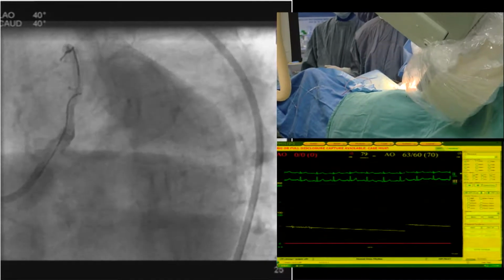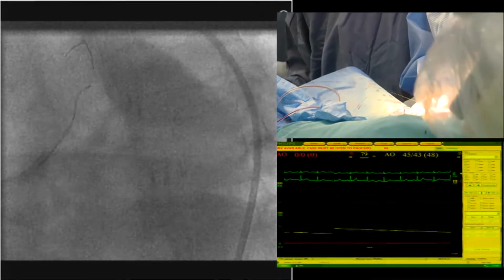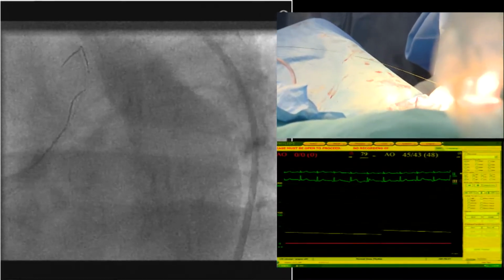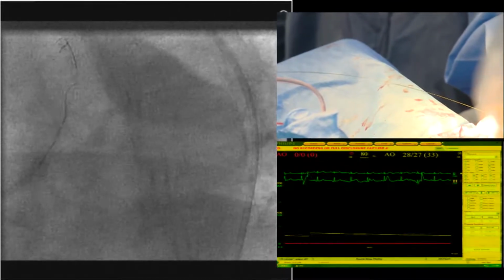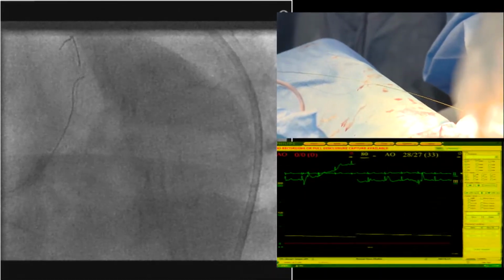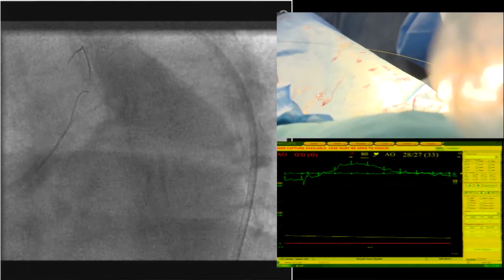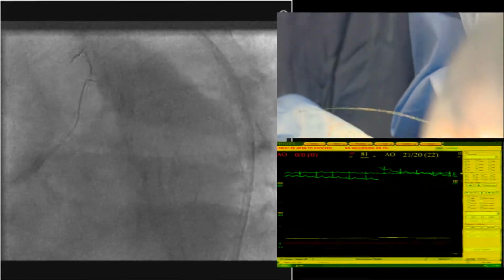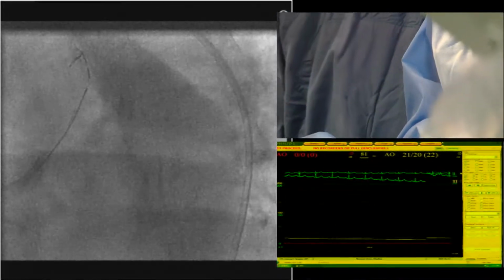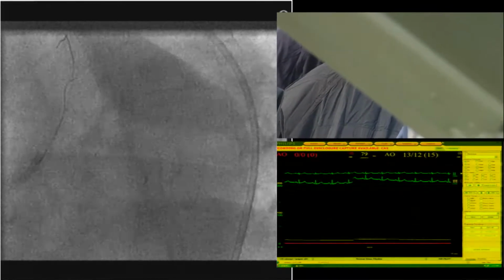If the patient starts on dialysis, my usual approach is to do the so-called zero contrast or ultra-low contrast PCI. By ultra-low, I mean the ratio of contrast volume versus calculated creatinine clearance is less than 1. With this, we can prevent contrast-induced nephropathy.